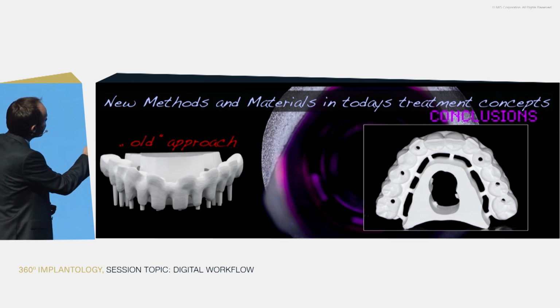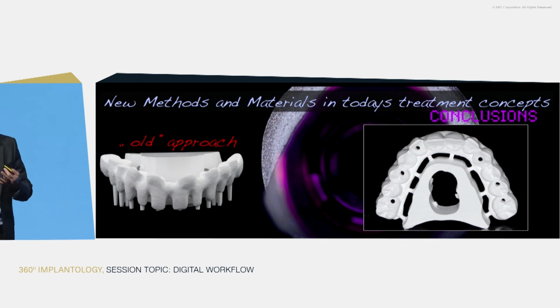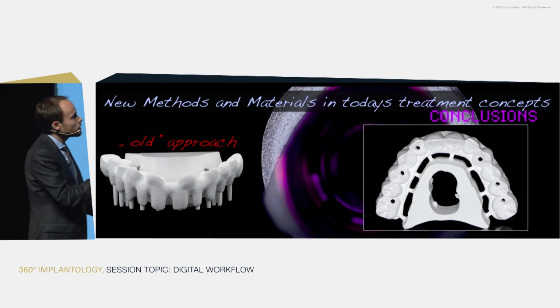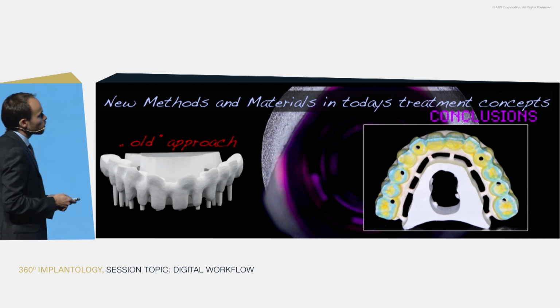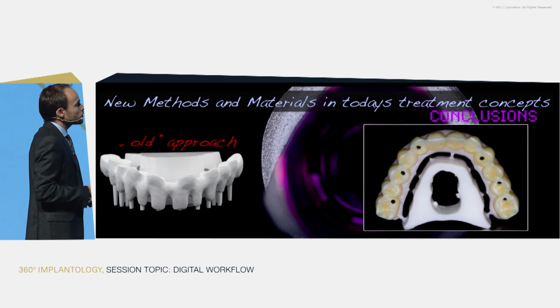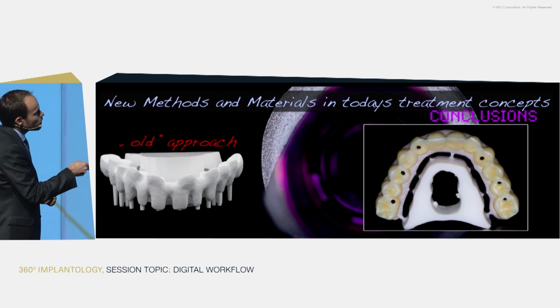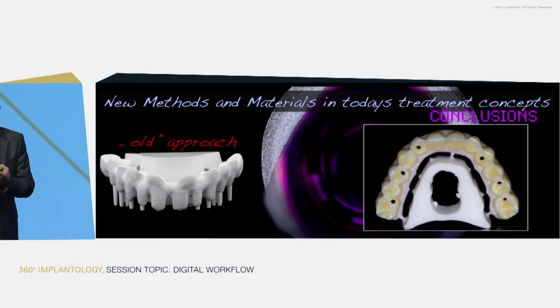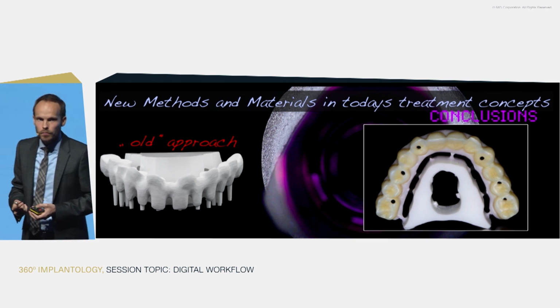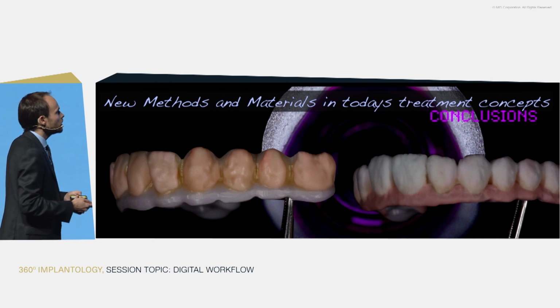Once again, it's also very nice to look back into your drawer, at all the cases that I did, and look at how invasive we were with our layering technique compared to what we see and use today. This is the frame before the sintering, after the infiltration process, and finally after the sintering. And you see once again the complete occlusion is monolithic. The complete frame is, I would say, 85% monolithic, and there's only a buccal veneering needed.